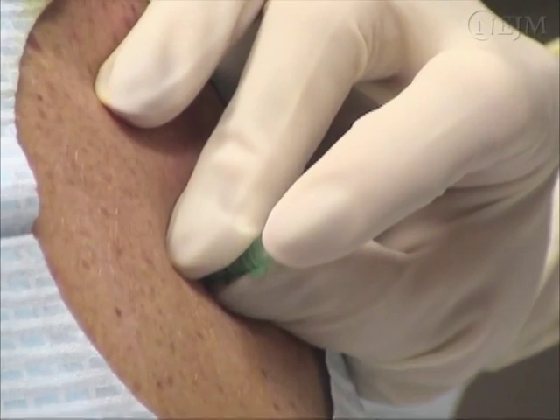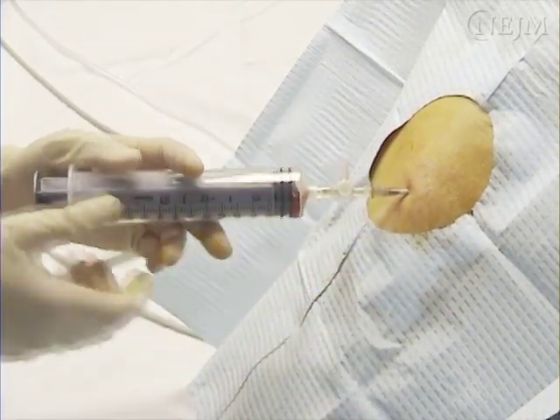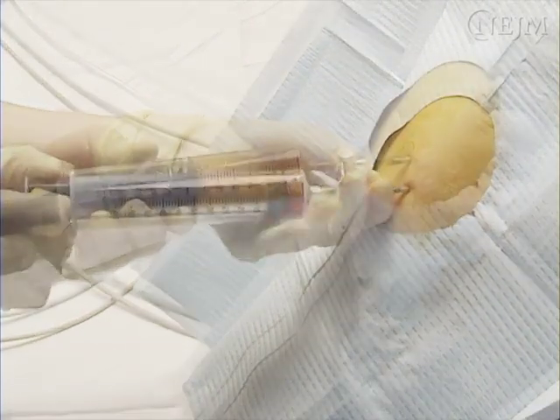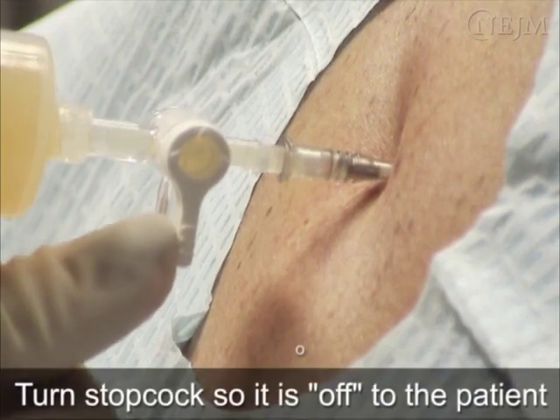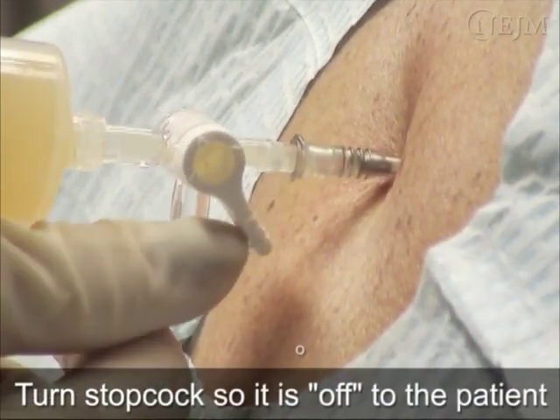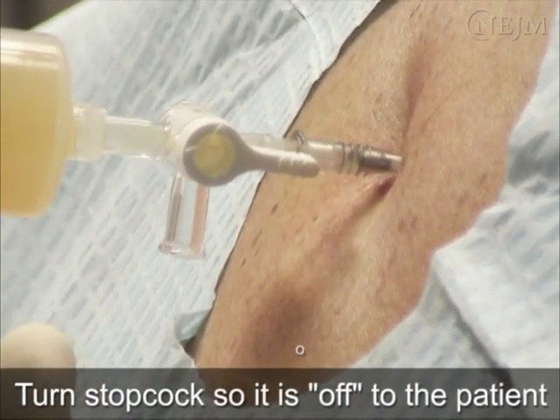Next, attach the three-way stopcock and large syringe to the catheter and continue to aspirate fluid. When this syringe is full, adjust the stopcock so that it is closed to the patient. The stopcock should be open to the patient only when fluid is being actively drained.